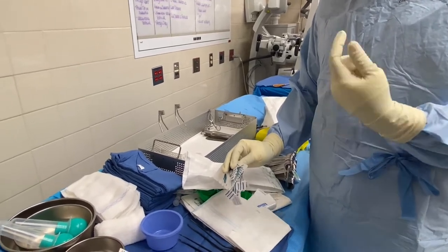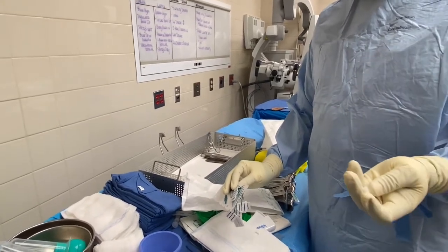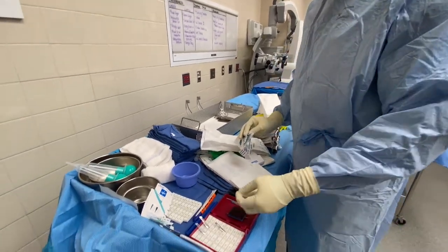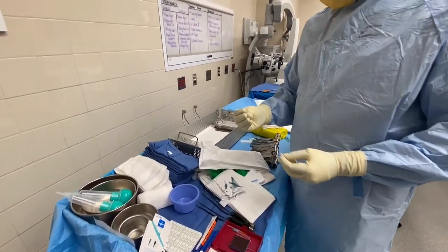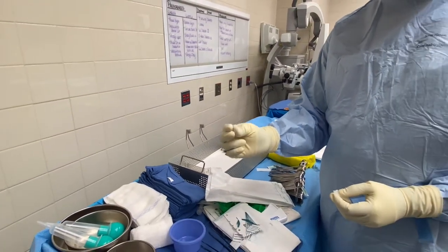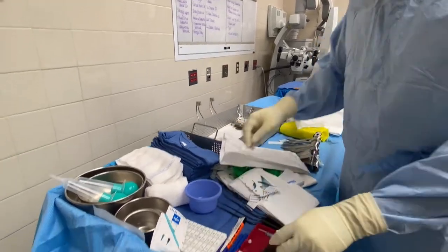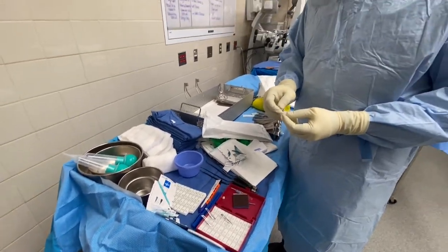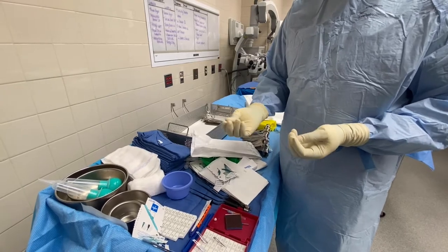Some surgeons don't like the name freer — they say wax on a stick. For example, a surgeon might say 'give me wax on the freer,' and sometimes they say 'wax on my finger' — you roll it and give it to them on their finger, or you can put it on a straight clamp to make it easier. That helps stop bleeding at the bone — it'll slow it down enough to work.